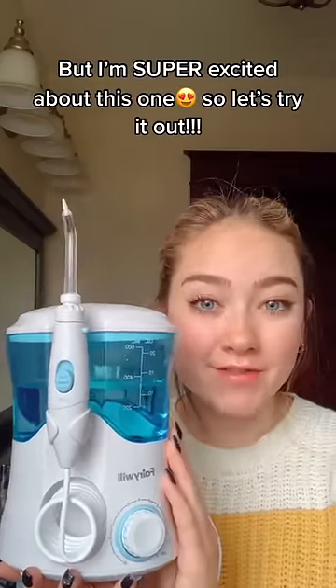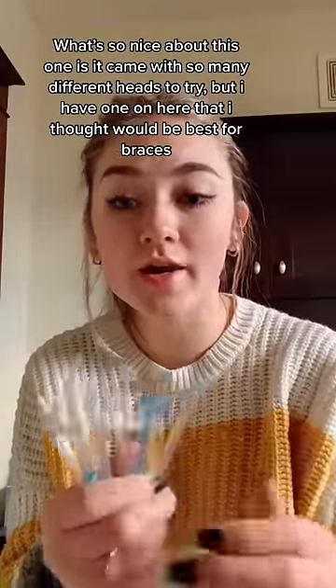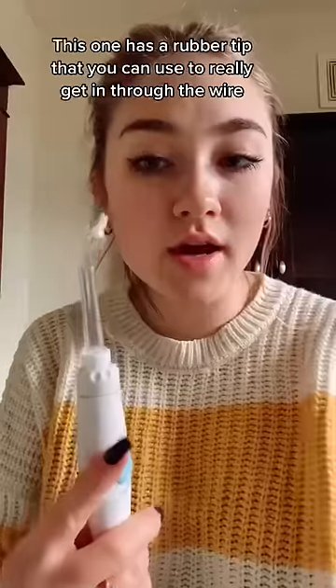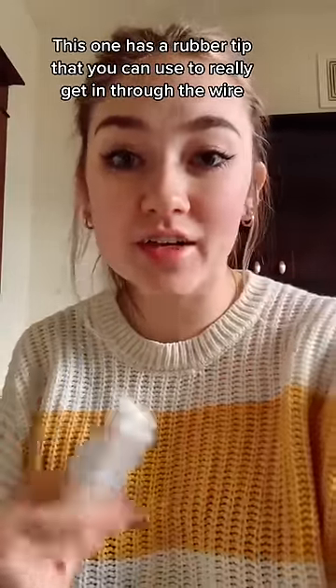I'm super excited for this one. What's so great about it is it came with so many different heads that you can try, but I have the one on here that I think would be best with braces. This one has a little rubber tip, and you can use it to kind of get in there and get through the wire.